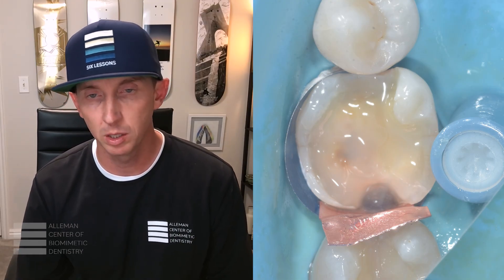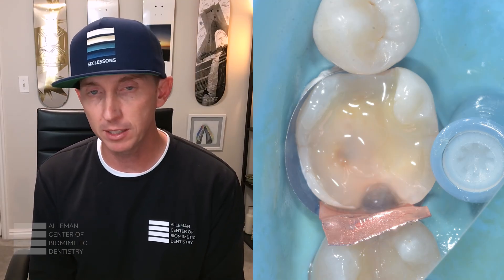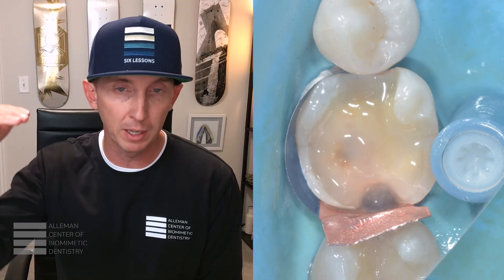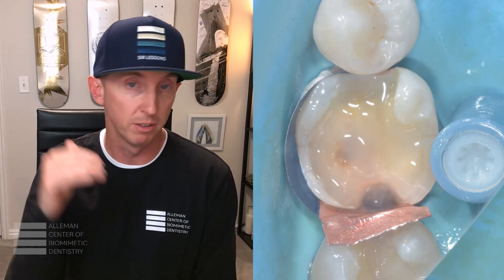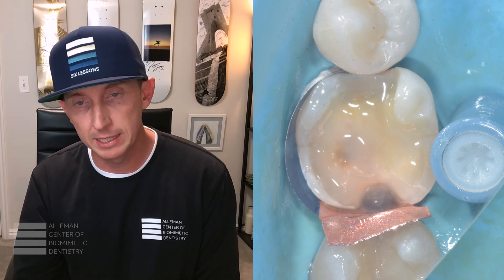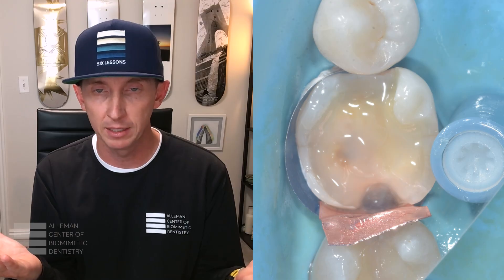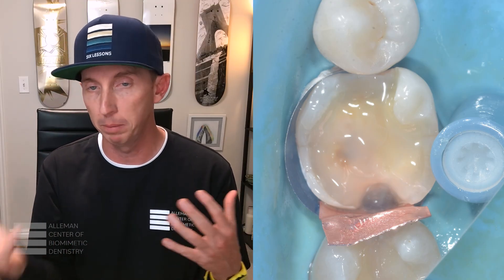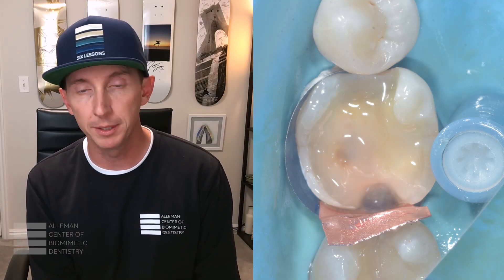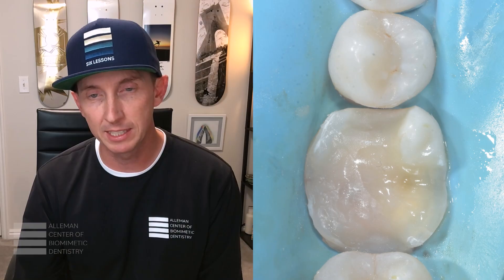As we continue the process, we need to analyze: does this preparation have high, medium, or low C-factor? C-factor, when ignored, creates a loss of bond strength of upwards of 50% — so instead of 50 or 40 megapascals, you're getting 25 or maybe only 20 megapascals. How you mitigate the stresses in this dissection will be different than in the rest of the preparation, which looks relatively flat. An easy way to analyze C-factor is to ask: does it look like a plate, a bowl, or a cup? The majority of this preparation looks like a plate, but in the crack dissection, that looks like a cup — medium to high C-factor — and as we layer, we need to use thin increments.